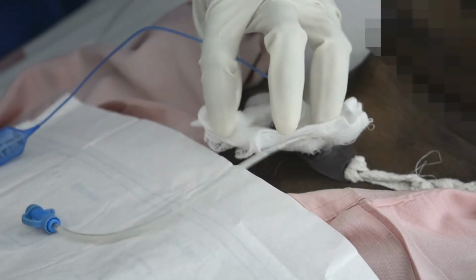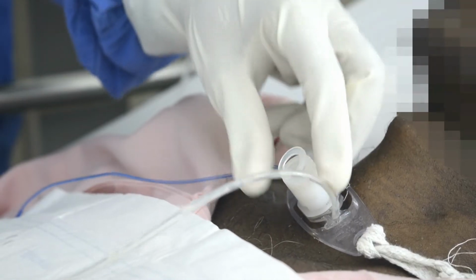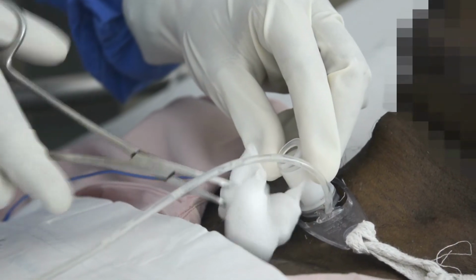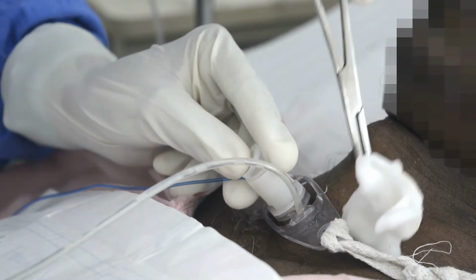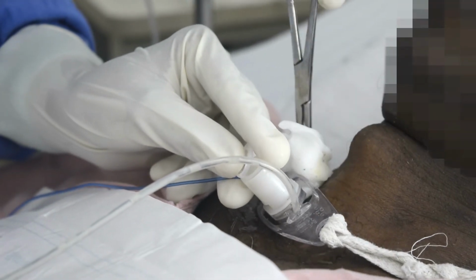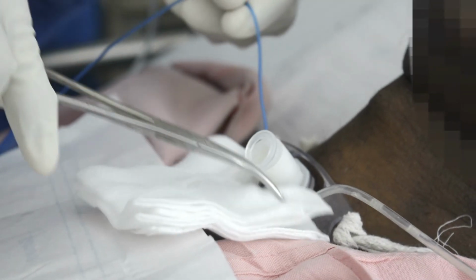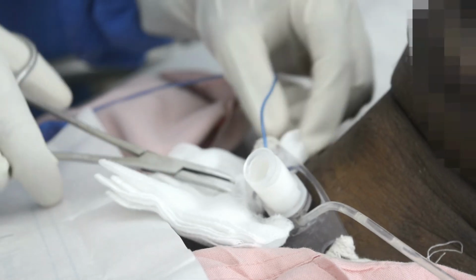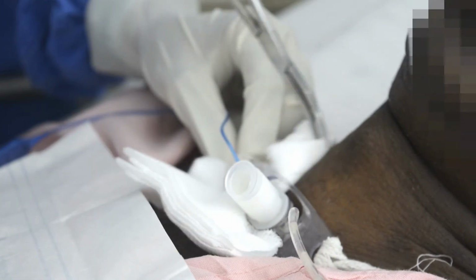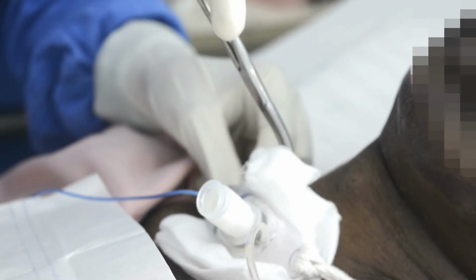Now she is about to give the routine care with wet saline gauze. Clean the area thoroughly. Inspect if there are any leftover sutures, otherwise they get embedded and it will be difficult to remove them later. Watch for any skin redness or ulceration. Keep the sterile cut gauze carefully at the lower part. One gauze will be enough to cover the trach tube area.